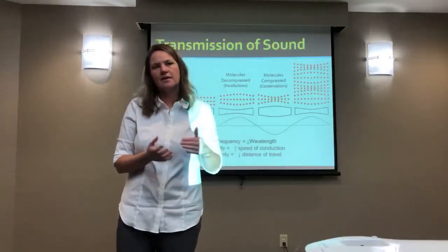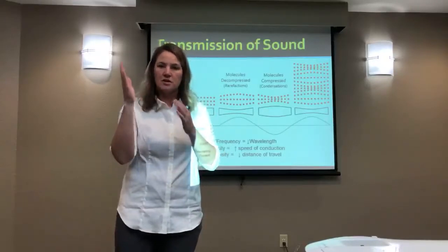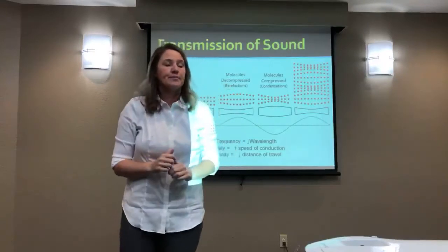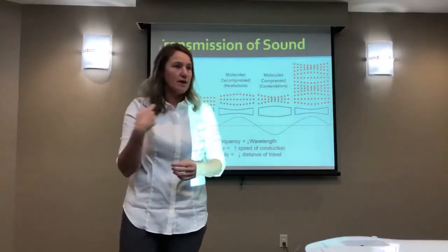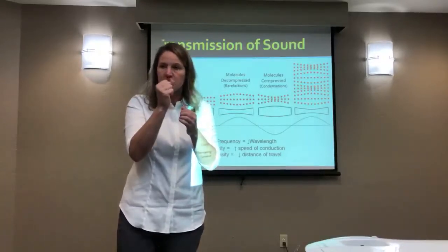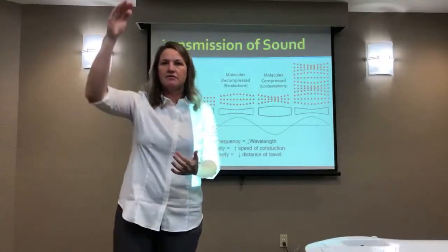So if you just think about that, the wave that's created with ultrasound is the same type of wave, just a different frequency. So it's pushing and pulling, and it's causing the molecules in your tissue to vibrate. One molecule vibrates, and then the next one does, and then the next one, and it passes on and on. If you think about an arena, when they do the wave, how the wave goes around, think of the people in the arena as the cells of your tissue. They vibrate, and then it moves on to the next one, and then the next one. It's the same idea.